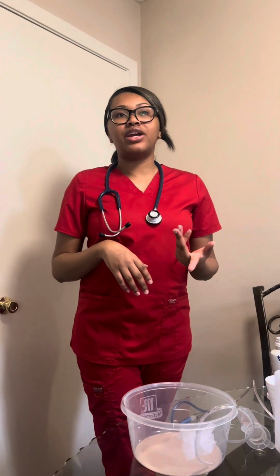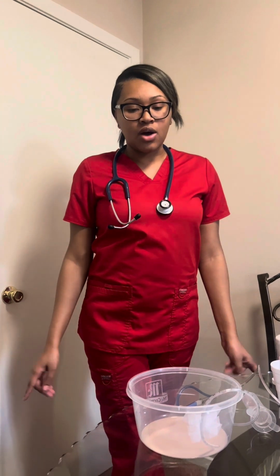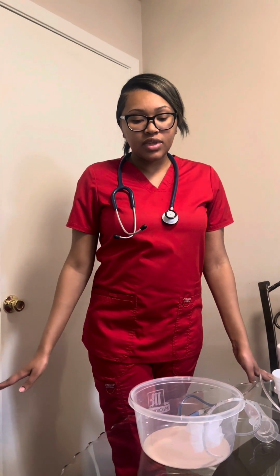I would also check the gastric content residual every 4 hours to make sure that the patient is tolerating the feedings. And then I will also check lab values. I will be checking for pre-albumin, albumin, and transferrin. And if there are any abnormalities in those, then I will notify the doctor.